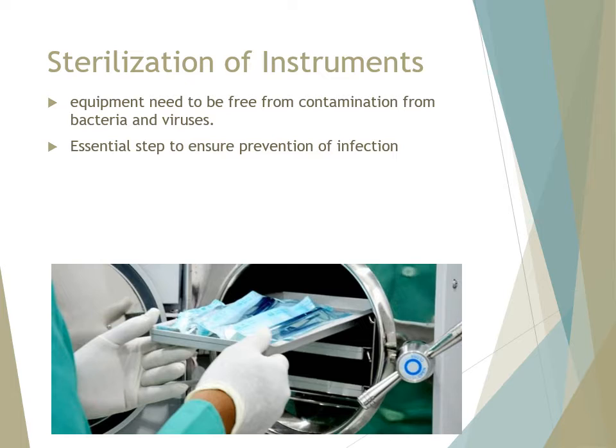Now, the skin is a protective element of our body. So when you open that up, you are actually really allowing bacteria and viruses to enter. So dapat ang equipment that you're using should be clean and sterilized.